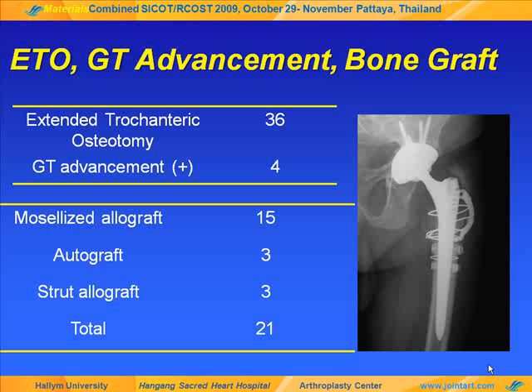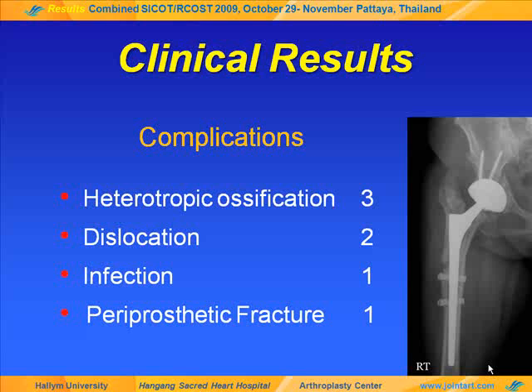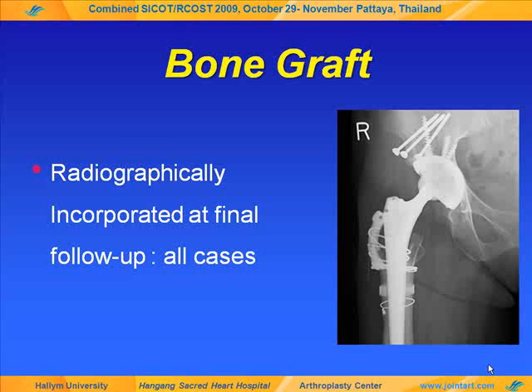Extended trochanteric osteotomy was performed in 36 hips and 21 hips required bone graft. At final follow-up, Harris hip score was 90.13 and no revision was required during the follow-up period. There were a few complications including two dislocations. There were no radiological findings related to loosening and osteolysis at final follow-up, and wear was not measurable. Bone graft was incorporated in all cases at final follow-up.